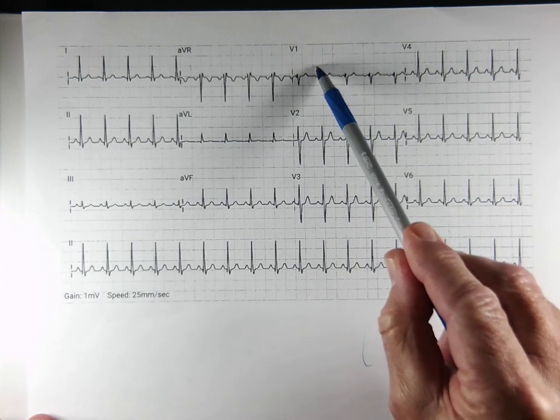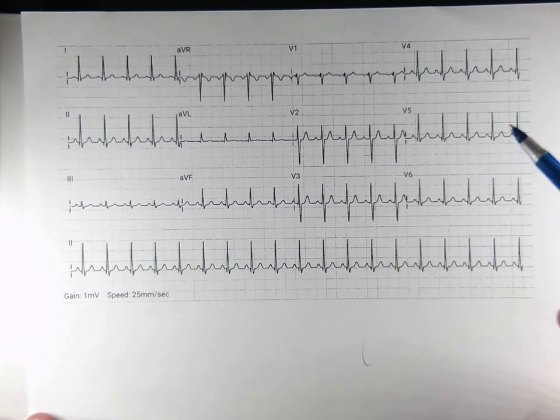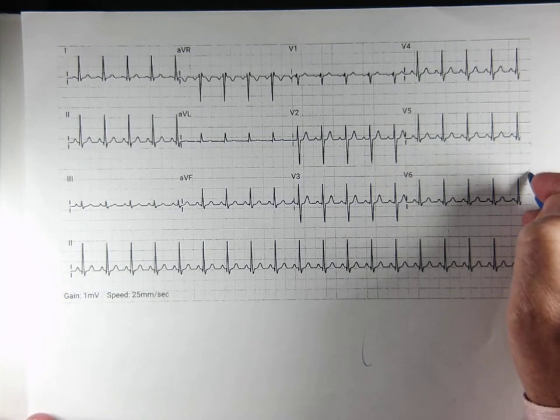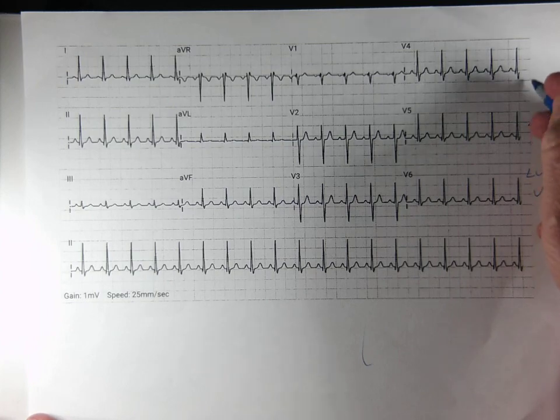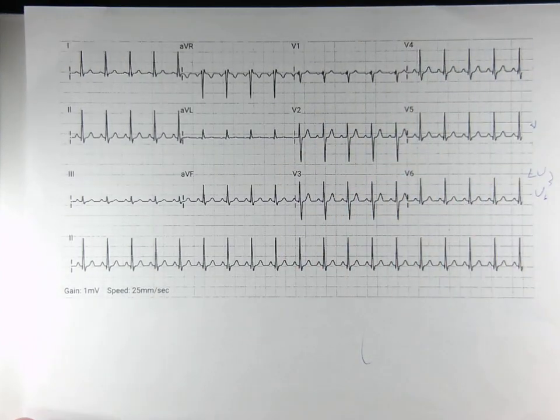As we go from the right side of the chest, anterior, and wrap around towards the left lateral chest coming this way, the R waves get bigger because V6 is sitting on the lateral part of the chest. That's where the LV is. Same with V5, V4. So we get more electricity in these leads because the electricity from the left ventricle is heading right towards them. Okay?